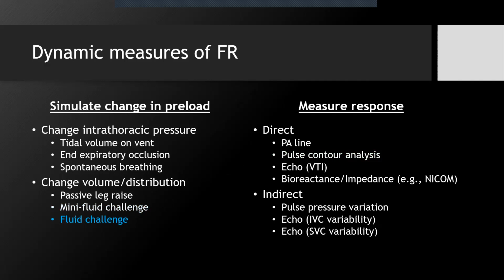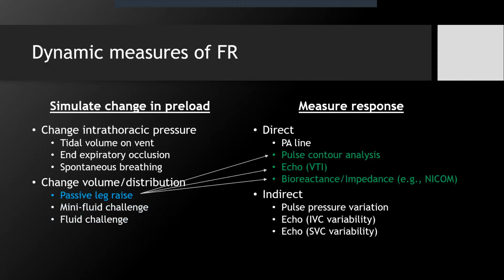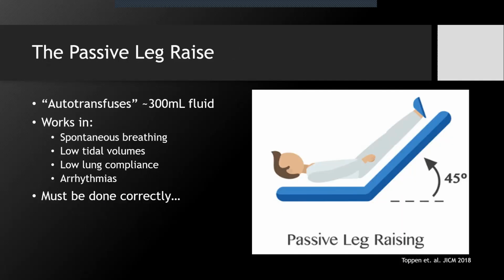I'm not really going to talk about an actual fluid challenge, because that defeats the whole purpose of this entire talk. So now I'm going to focus a little bit more on the passive leg raise. And the passive leg raise is actually really substantial, easier to do than you think. It's been connected with pulse contour analysis, echo VTI, impedance, and bioreactance with really great reliability. And so it's important to first know what exactly is happening.